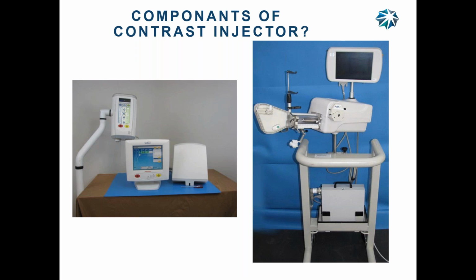You can run up to 5 patients without replacing the syringe, the setup, the tubing, except the tubing going to the patient. And they can do that because the chain of contrast, the chain of saline, is never broken inside the machine. All they have to do is repurge it and then connect it to the patient.